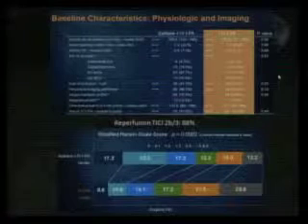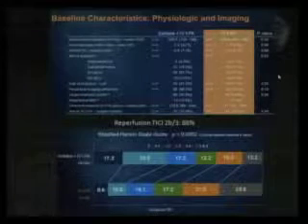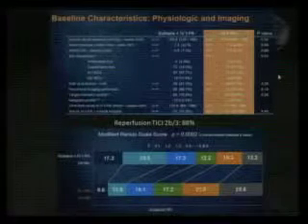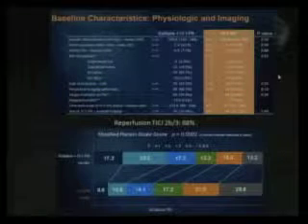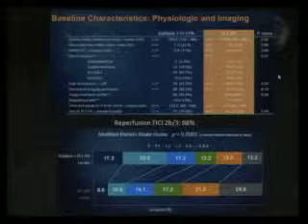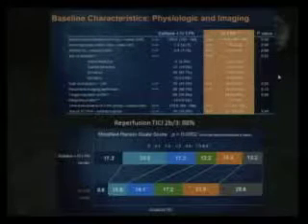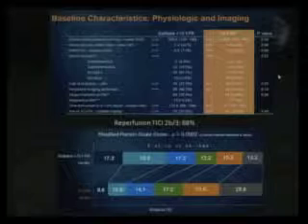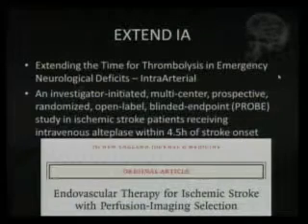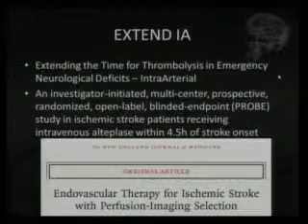The technical success for the stent retriever was 88% of the patients had reperfusion TICI 2b or 3, and this is an analog of the TIMI recanalization scale for coronary arteries. So this is for cerebral recanalization, where TICI 2b would be recanalization of more than half of the territory that was previously occluded, and TICI 3 would be a complete recanalization, 100% recanalization. So more than half, or 100%, was achieved in 88% of the patients with that. That study is under review to be published also in the New England Journal of Medicine.